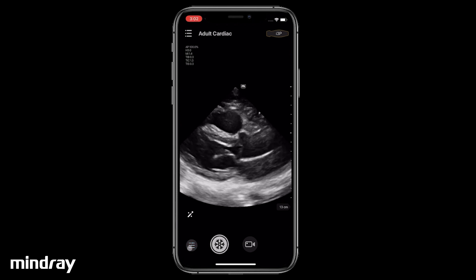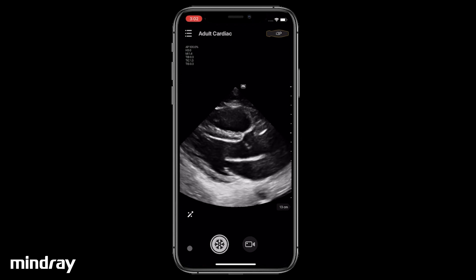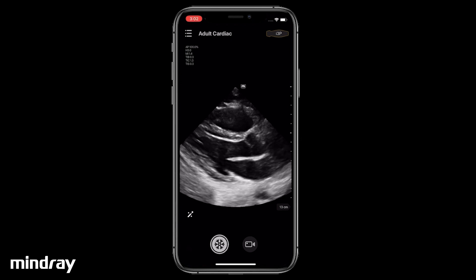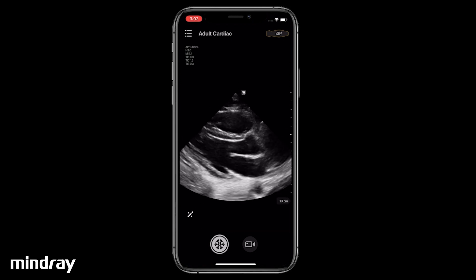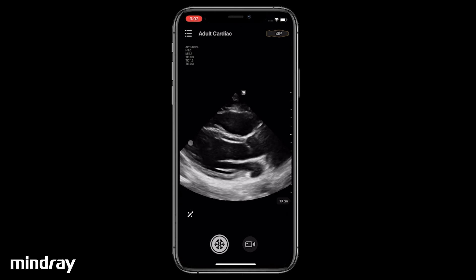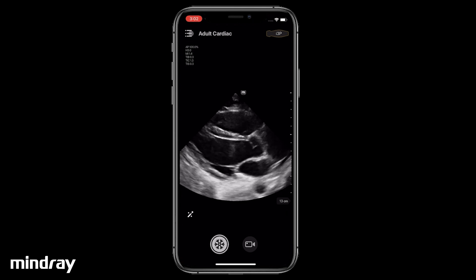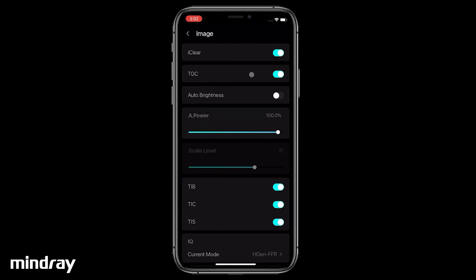Tap the TGC icon again to hide the sliders. Stretch two fingers to zoom in, pinch two fingers to zoom out. Tap the system tools button, then Setup and Image, for more parameters. Disable or enable iClear for speckle noise rejection.